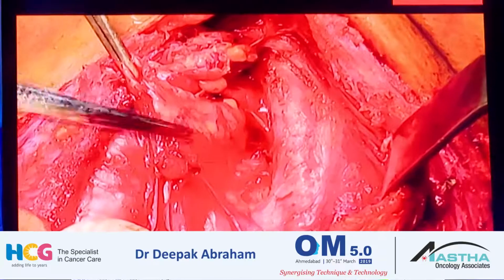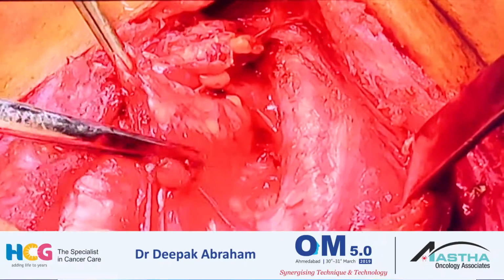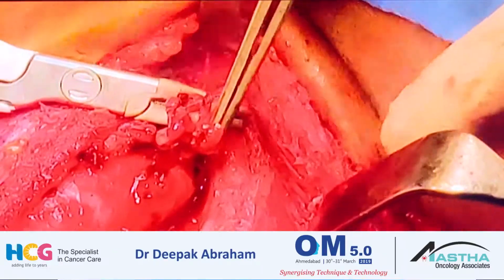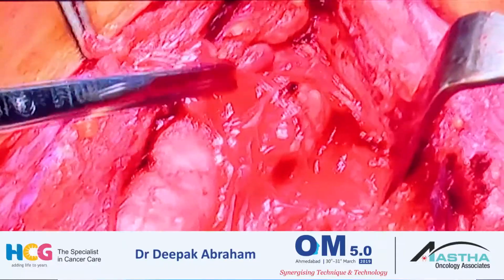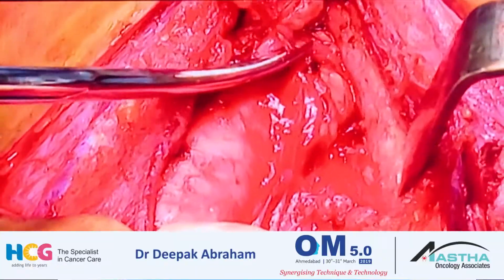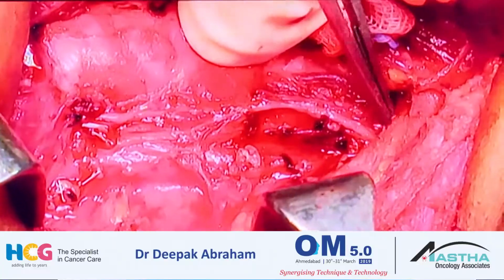So taking off the parathyroid off the central neck is a challenge. If you're not comfortable, auto-transplanting the inferior parathyroid in a central neck dissection makes more sense than to leave behind a devascularized parathyroid. So that's the whole thing, and the final bit coming off, with both the nerves really skeletonized. So that's the nerve, yeah.